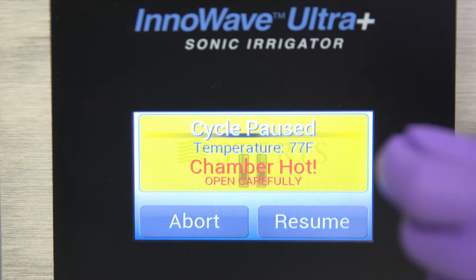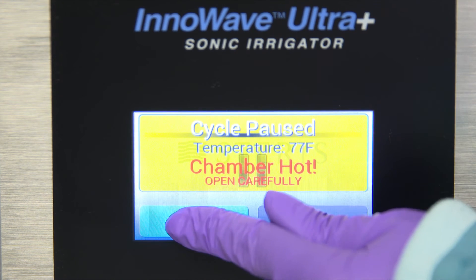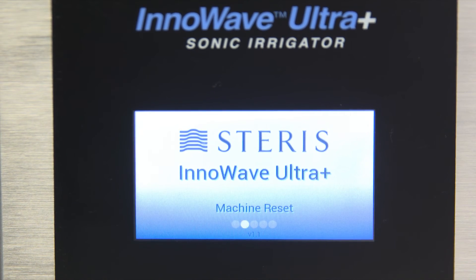Occasionally, you may need to stop a cycle before it is complete. Press the cycle pause button to pause the cycle. You will now see the cycle paused screen. Select abort to cancel the cycle. If the abort sequence is confirmed, the unit will automatically drain.